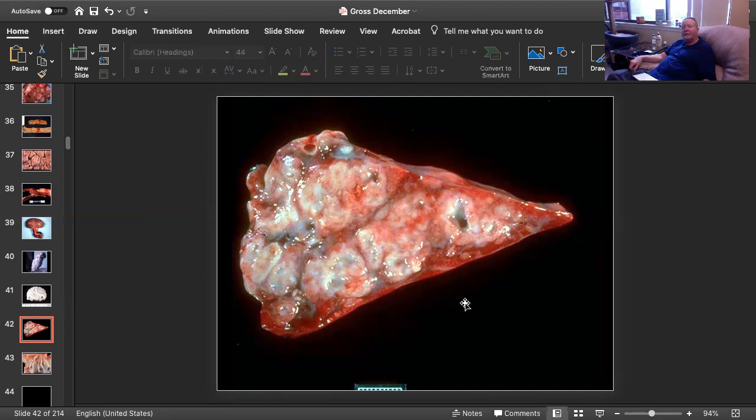Okay, time's up. We're looking at a section taken at the periphery of the lung, and we have multiple coalescing pyogranulomas. I really only have one differential. If you're given that this is a foal, perhaps 4 to 6 to maybe even 8 months of age, this is caused by Rhodococcus equi.